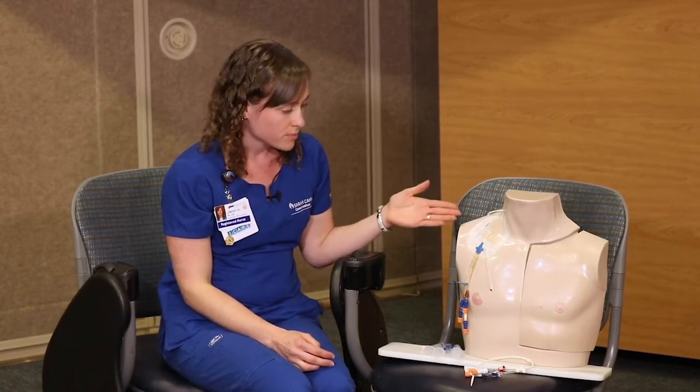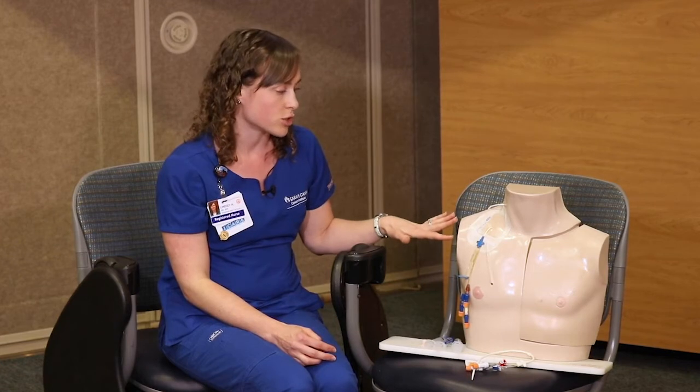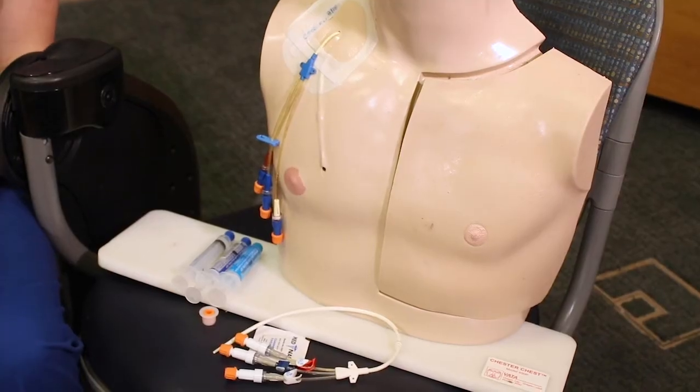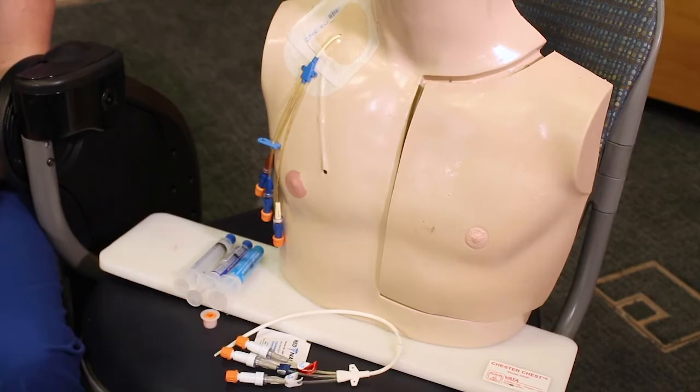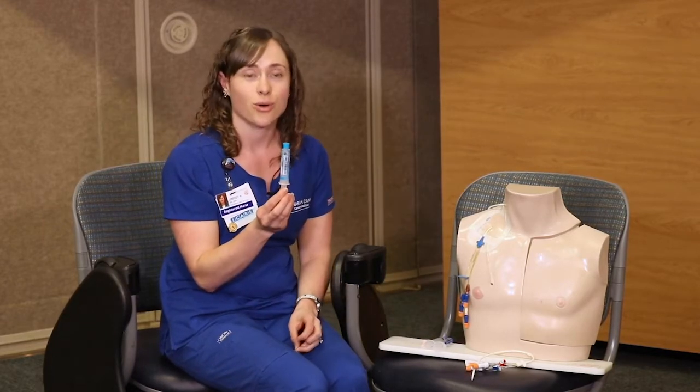This is just an example of a Trifusion catheter. This dummy has a dressing over the Trifusion. When you're at home, you will most likely no longer have the dressing, which is why you'll be doing the line care. You'll do a chlorhexidine swab every day, preferably after you shower. You'll also be flushing each lumen with heparin flushes. This is the daily line care that you will be doing.